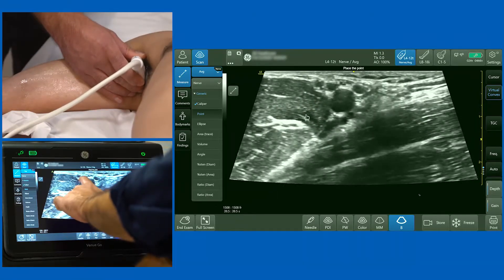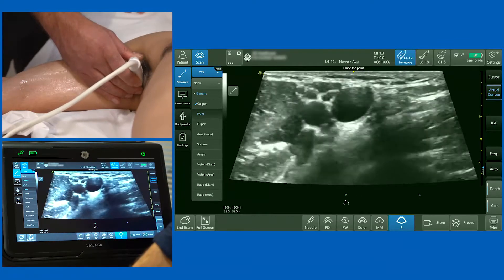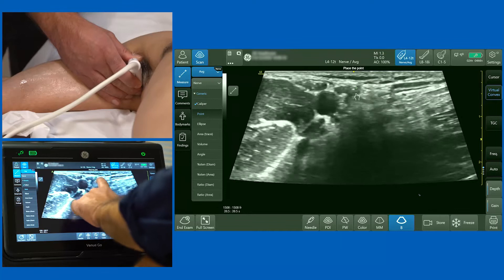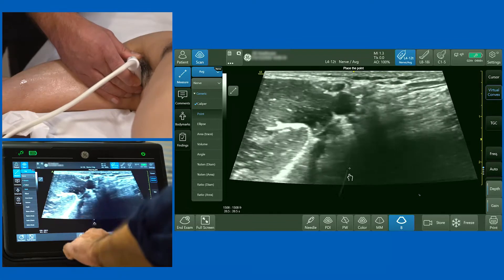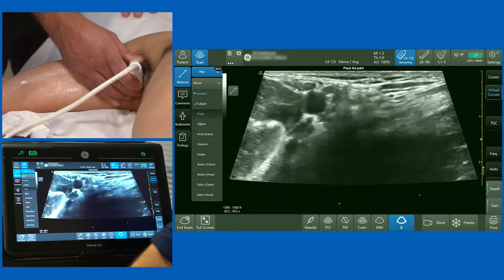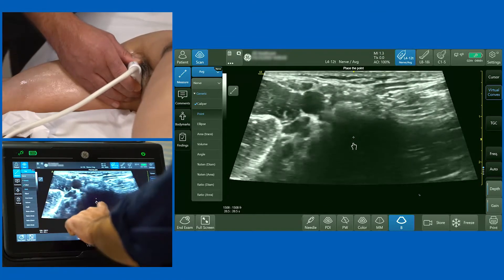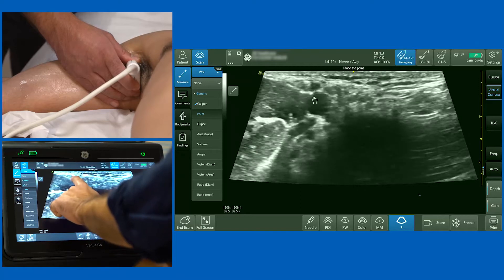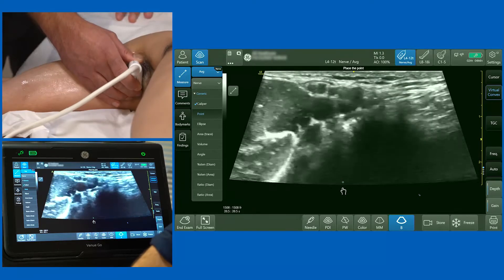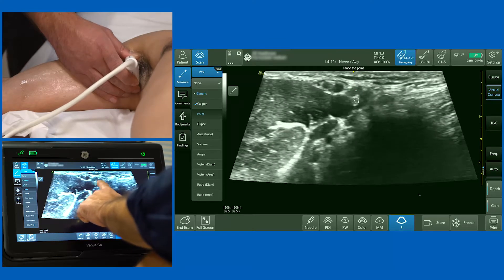We've now confirmed with the scan-down and trace-back method that this is the median nerve. Releasing and increasing pressure again, another structure becomes visible: the ulnar nerve, which generally lies between the axillary artery and the vein or multiple veins. It produces an appearance almost like Mickey Mouse ears, with the axillary artery forming the head and the ulnar nerve forming two ears.